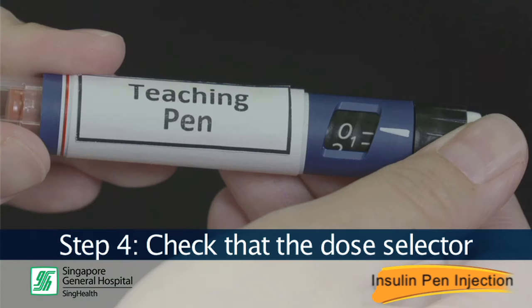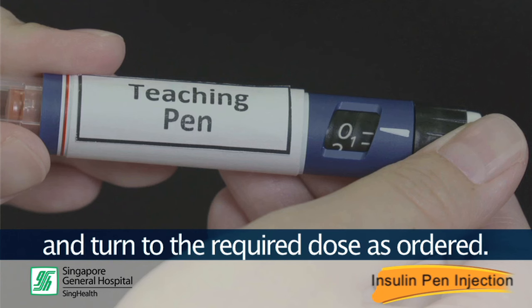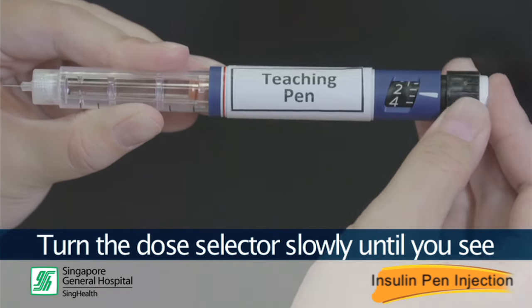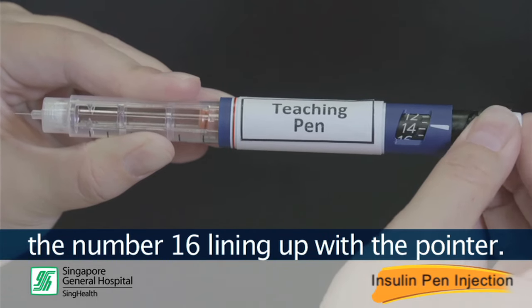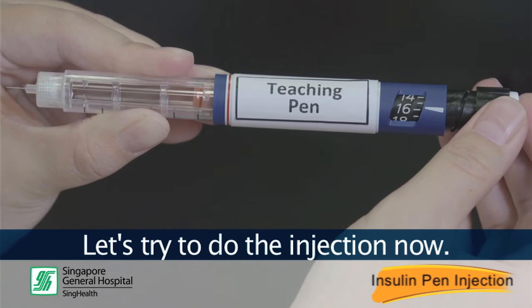Step 4. Check that the dose selector is set at zero after the safety check, then turn it to the required dose as ordered. Dr. David has prescribed 16 units. Turn the dose selector slowly until you see the number 16 lining up with the pointer.